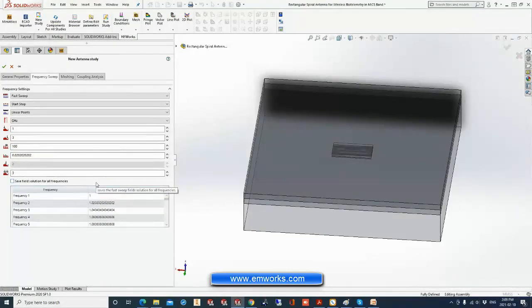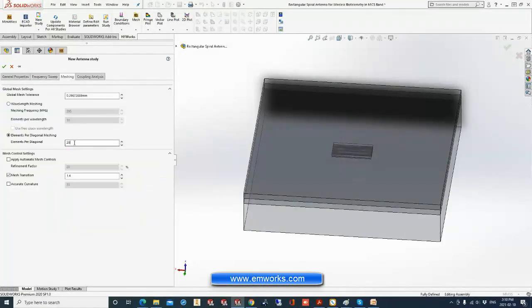In general, we always start with the fast sweep to predict the band, the resonance frequency. After this, we can do another simulation to solve some frequencies inside the band. So here we'll define just our band. For example, you can solve from 370 to 420 megahertz, and here you choose the number of points.